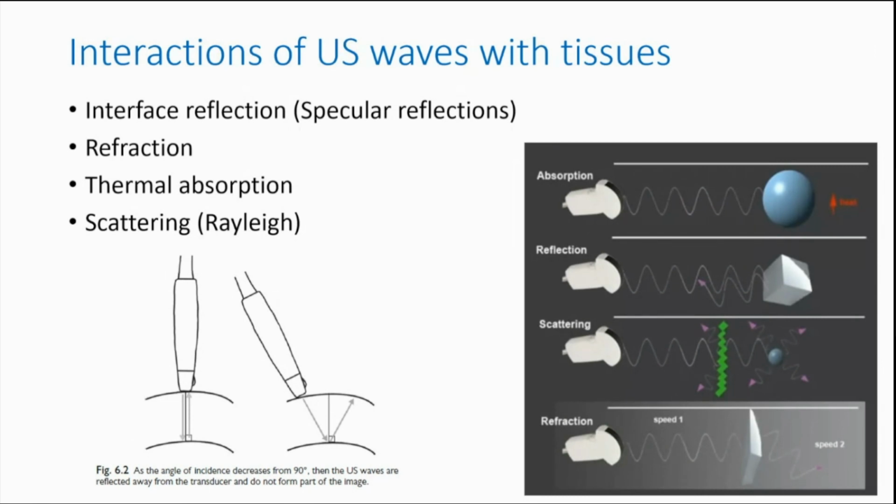Okay, any comments, questions? I have a question. How do we improve our needle visualization when performing deeper blocks such as anterior sciatic, for example? I think the key is knowing what you can do with the equipment that you have.